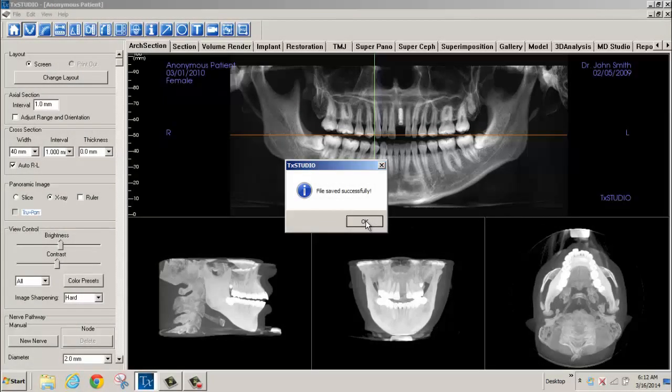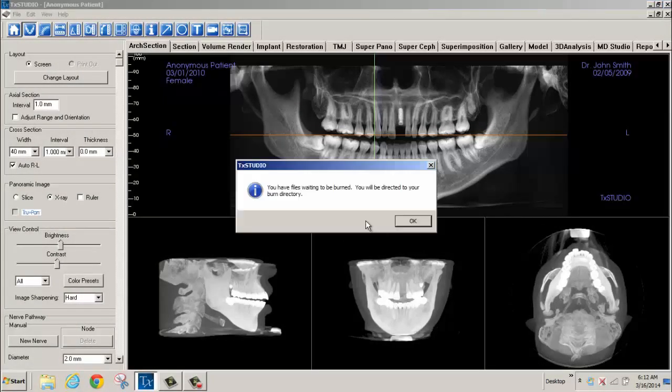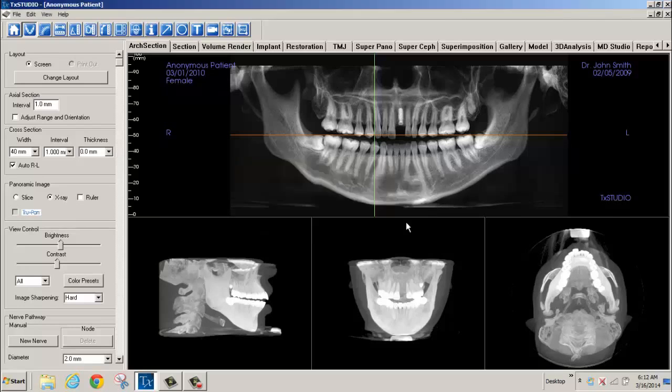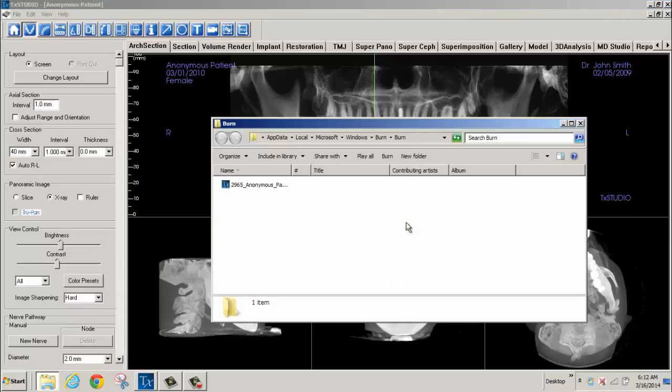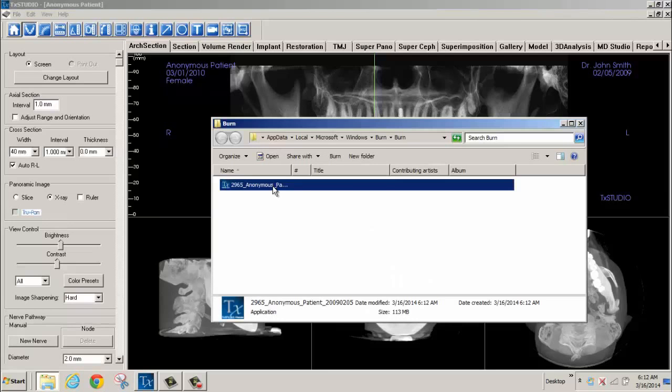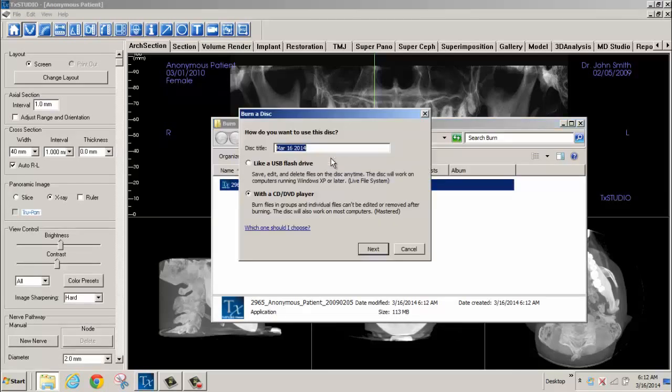You will then be directed to the burn directory. Click OK. Next, select the file to be copied to the CD by left mouse clicking and selecting Burn.